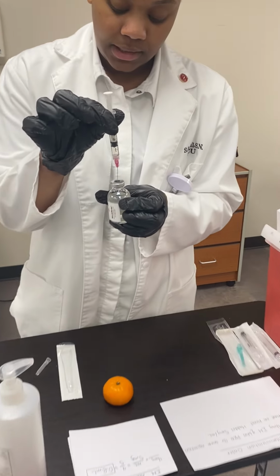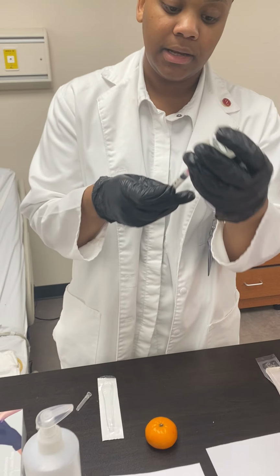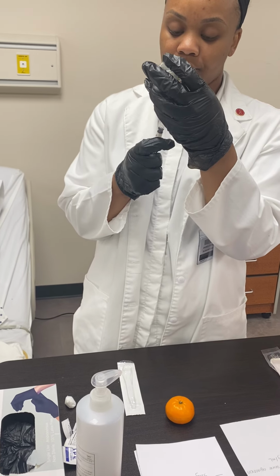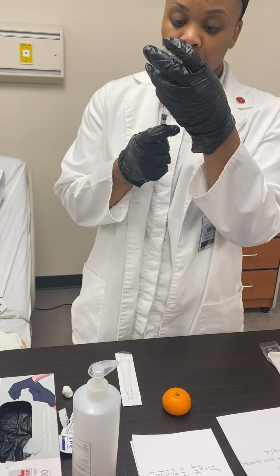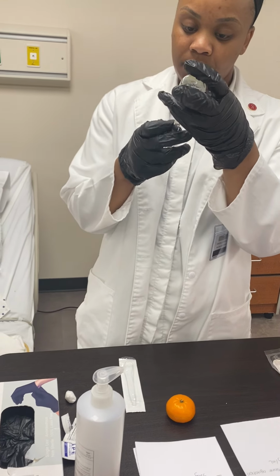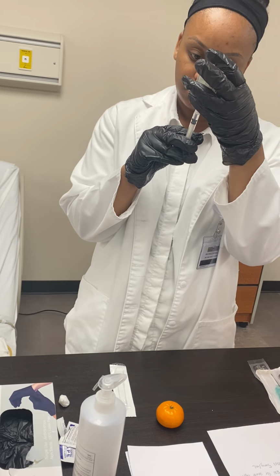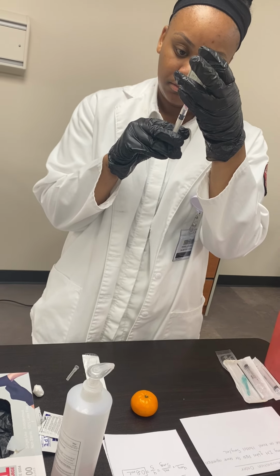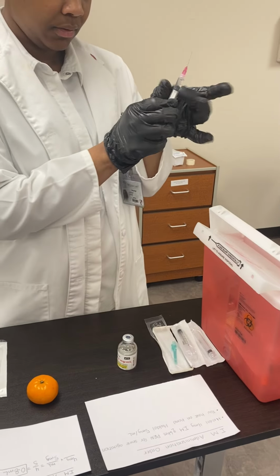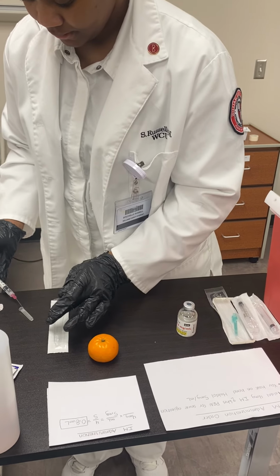Going to go ahead and inject that into the vial, inject the air. Then I will pull up 0.8 mils of Haldol. Trying best as possible to make sure I don't have any air bubbles. Okay, so I have 0.8 mils of Haldol.